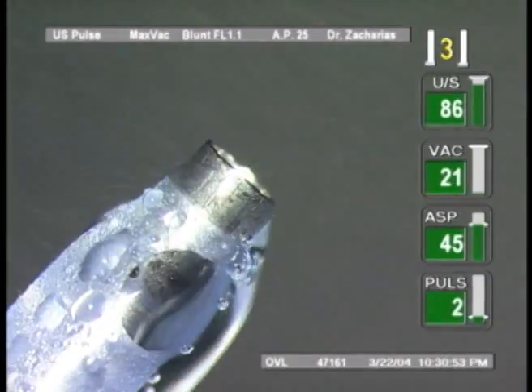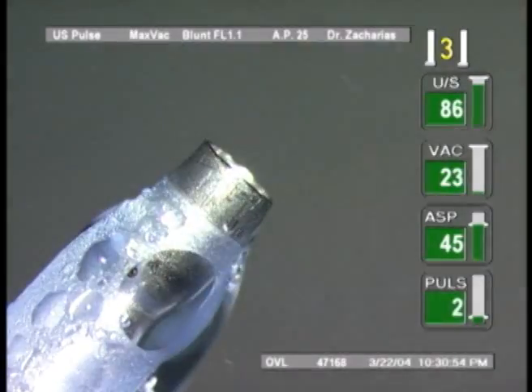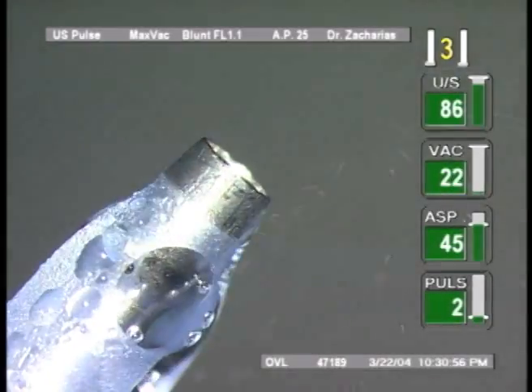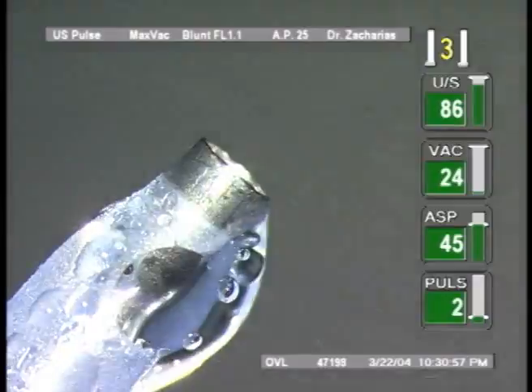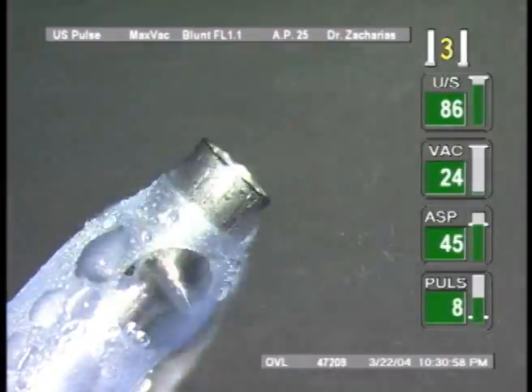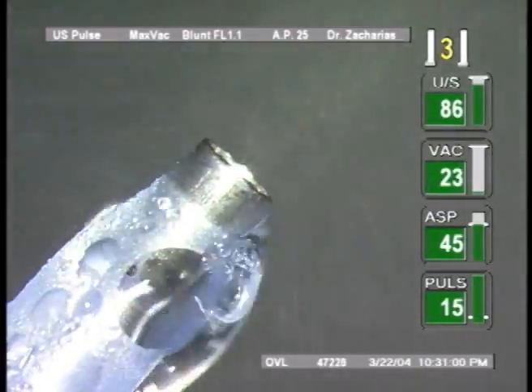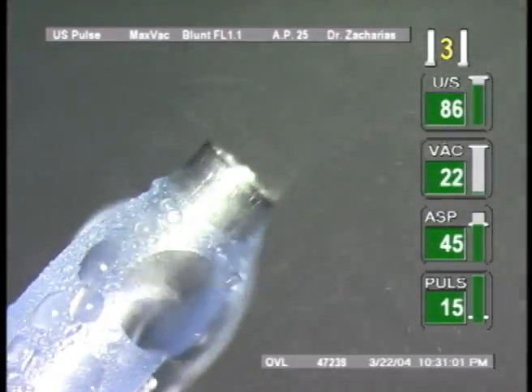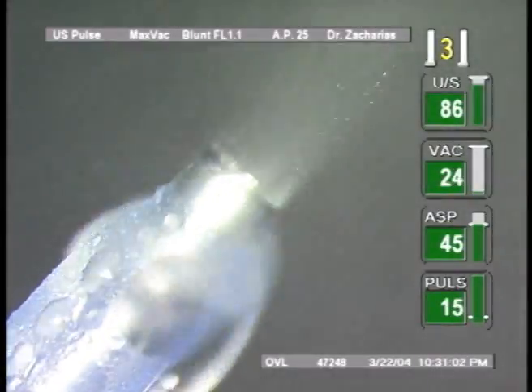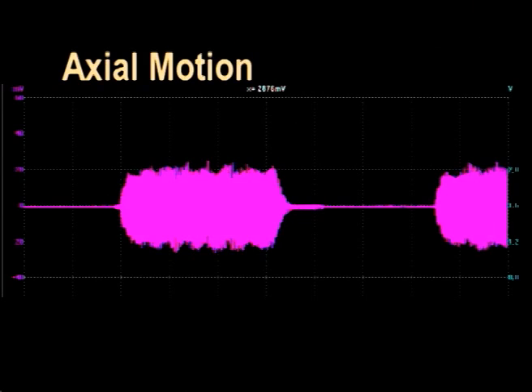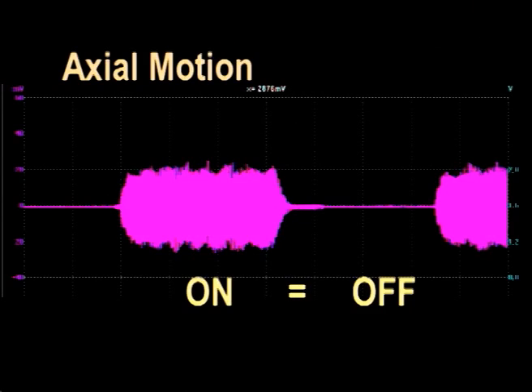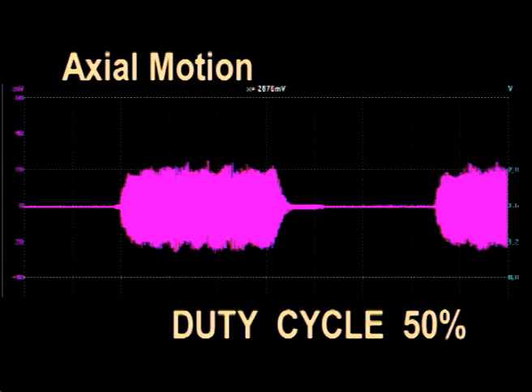Pulsation in FACO was introduced long ago permitting the intermittent administration of ultrasonic energy with equal intervals of activity and inactivity. This scheme is known as pulsed mode, having an equal on time and off time, or what's the same, a duty cycle of 50%.